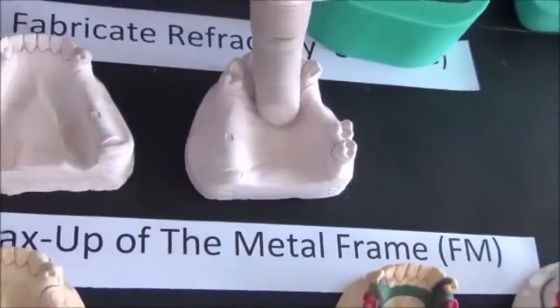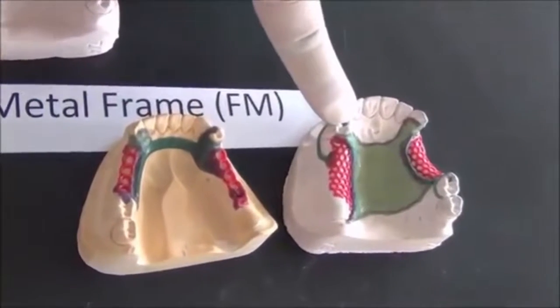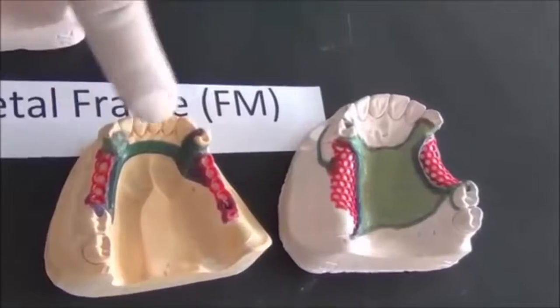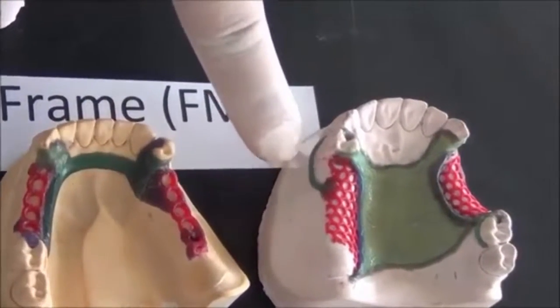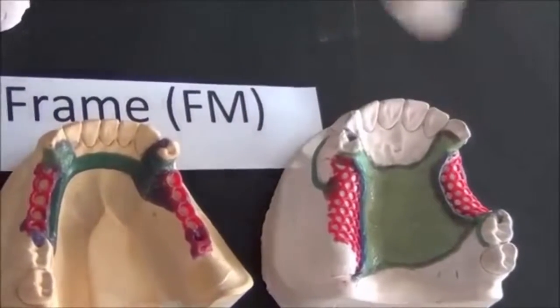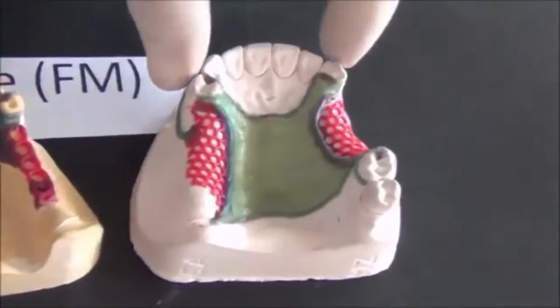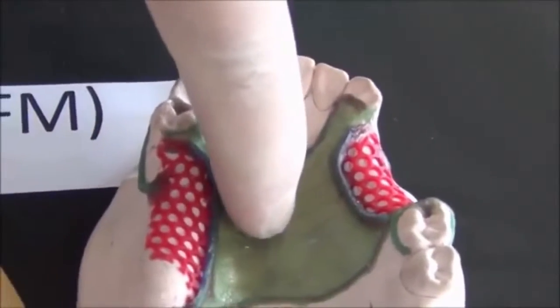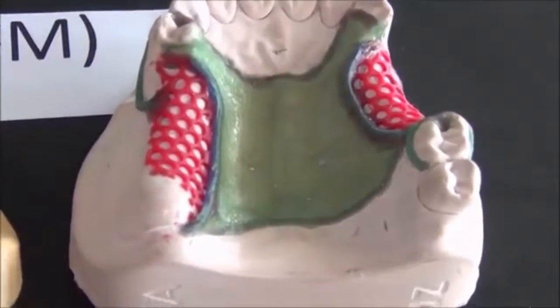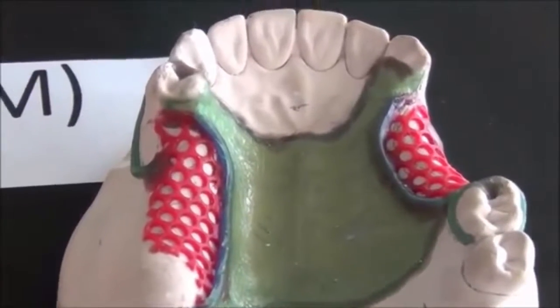After finishing constructing the refractory cast, now they are ready for the step we call wax up. The wax up is done using wax patterns. These wax patterns come ready, and they are in the same shape that we want our final metal framework to have. As you can see, they come in colors, they have different shapes, but if I look at them, they have specific measurements that I need to incorporate in my metal framework.